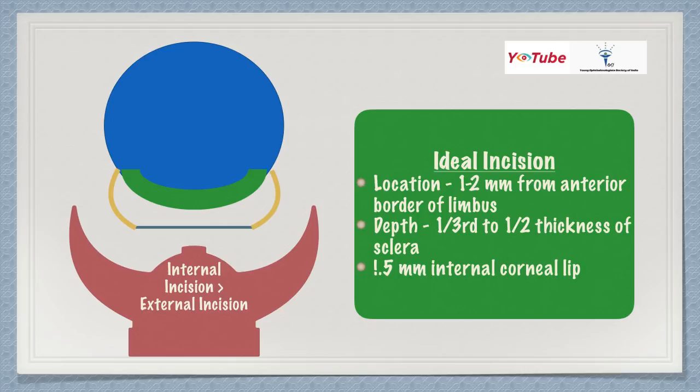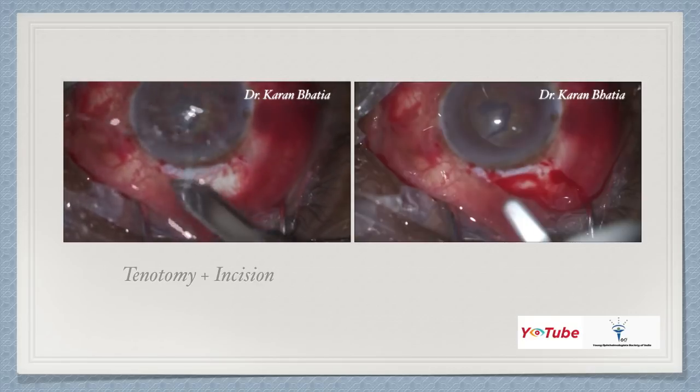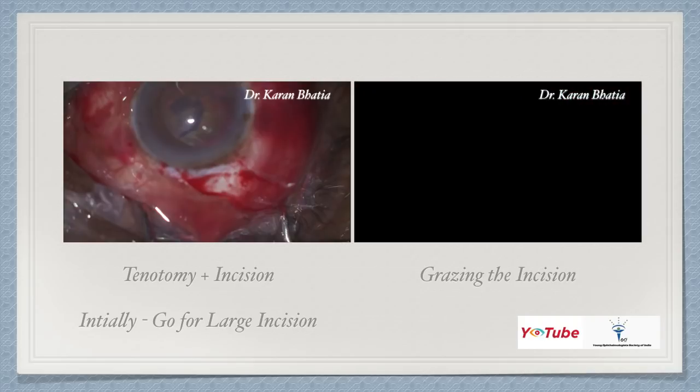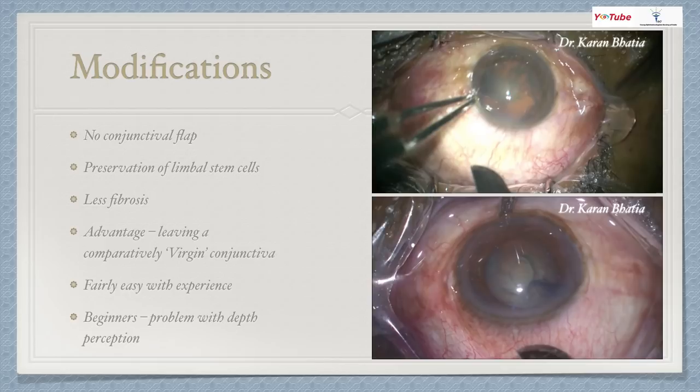In SICS, the internal incision is bigger than the external incision. The ideal incision is about one to two millimeters from the anterior border of the limbus, about one-third to half the thickness of the sclera, and goes about one to one-and-a-half millimeters into the cornea. The tenotomy is very important. After giving the incision, you can scratch with the blade. Initially, go for larger incisions and later shift to smaller ones. You can measure with calipers. The next step is grazing the incision using a crescent knife to find the plane for the tunnel.